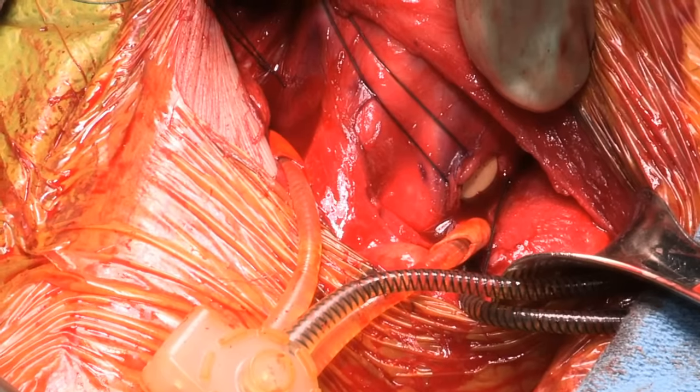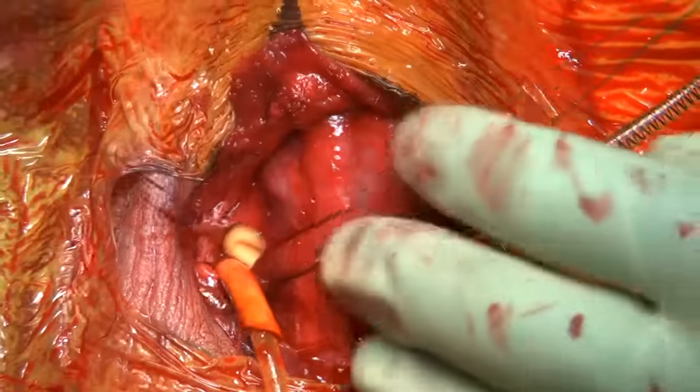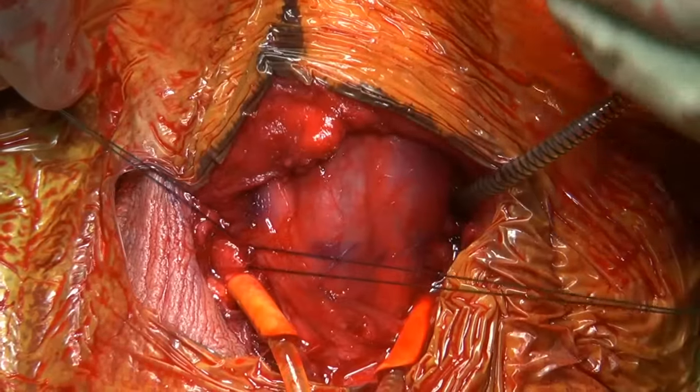Even with the stay stitches fully unapproximated, you can see that we've got good hemostasis already. Now I will close the corporotomies, tying our stay sutures in mattress fashion. And with this, we've got excellent apposition.